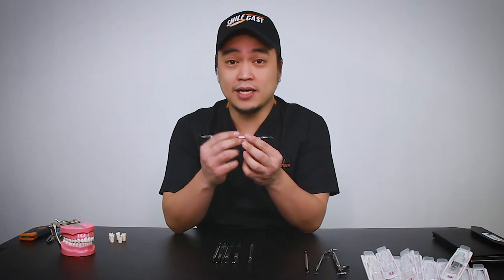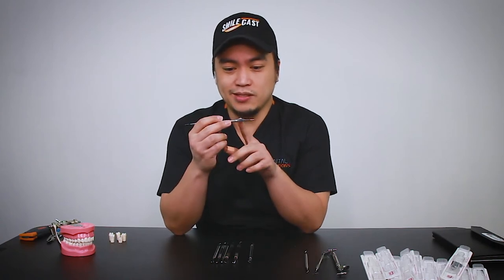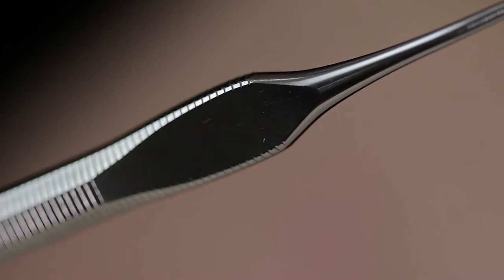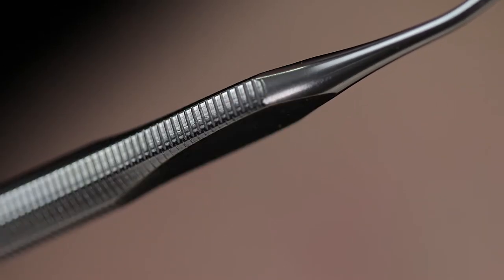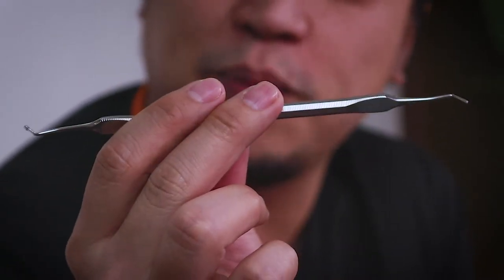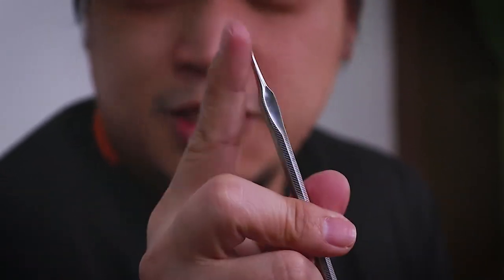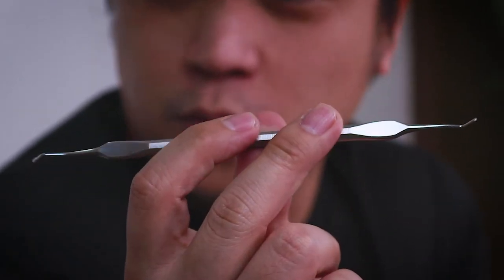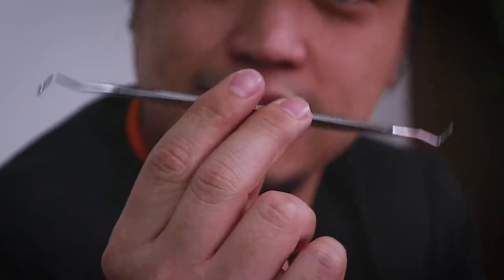Now we have the amalgam plugger. An interesting thing about this one is that there's a little notch — a flat area on the handle — which actually distinguishes it from the other instruments. This head is the big plugging head and here we have the slimmer, thinner plugging head, which allows you to work with both wide cavities and small cavities.